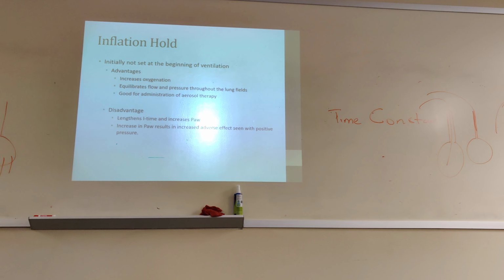So to optimize the benefit of albuterol on the ventilator, the respiratory therapist will institute inflation hold. That's what is going to help make sure that the medication will deposit very well.